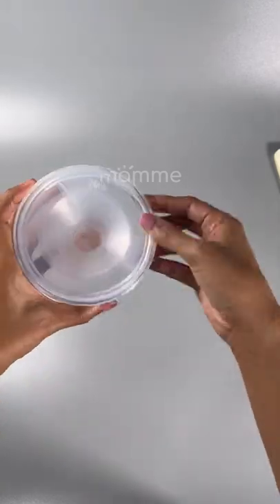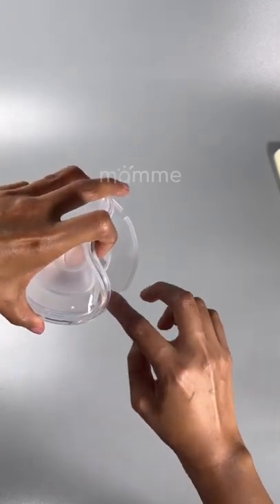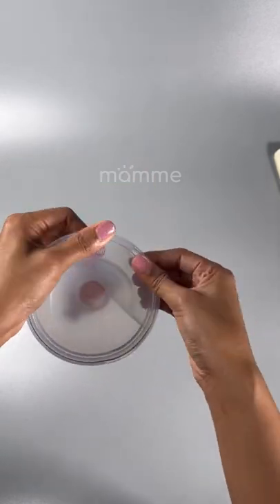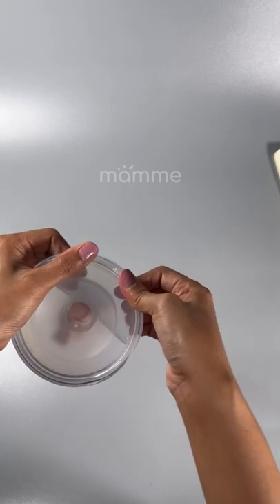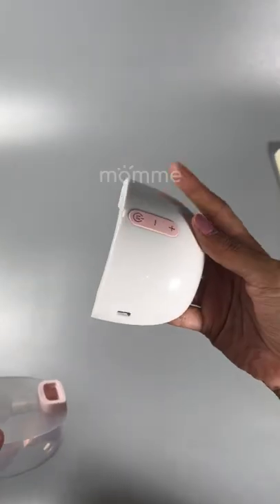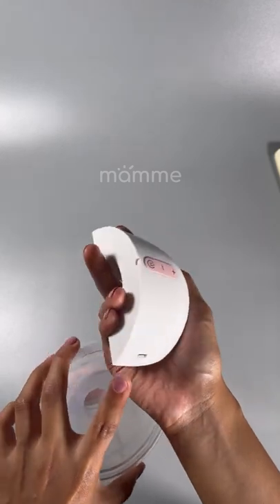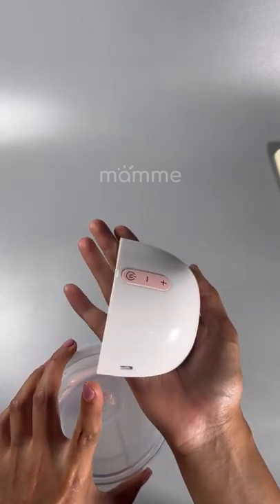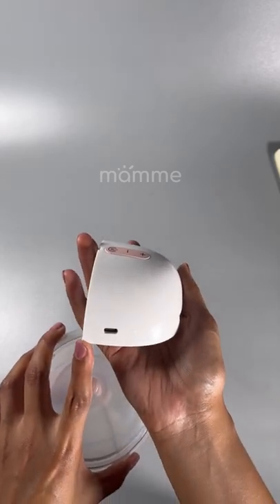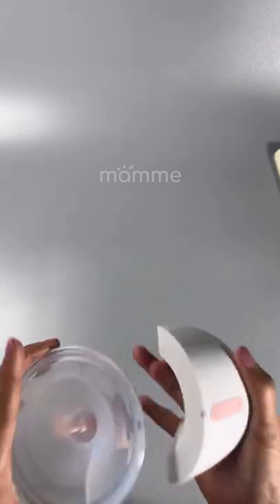Ako, kapag nagpo-pour ako, I lift this portion up. Ayan. And then, dito ako nagpo-pour. Ayan. Okay. This is one of the things that I'm not fond of sa Gen 2, but you know, I can live with it. Okay? So remember, mommies, when you pour, please remove this one before pouring. Kapag halimbawa, napasukan ng milk ang motor na to, your warranty is void. So, warranty for mame is 30 days for motors na defective. Okay? But, if napasukan ng milk, your warranty is void.